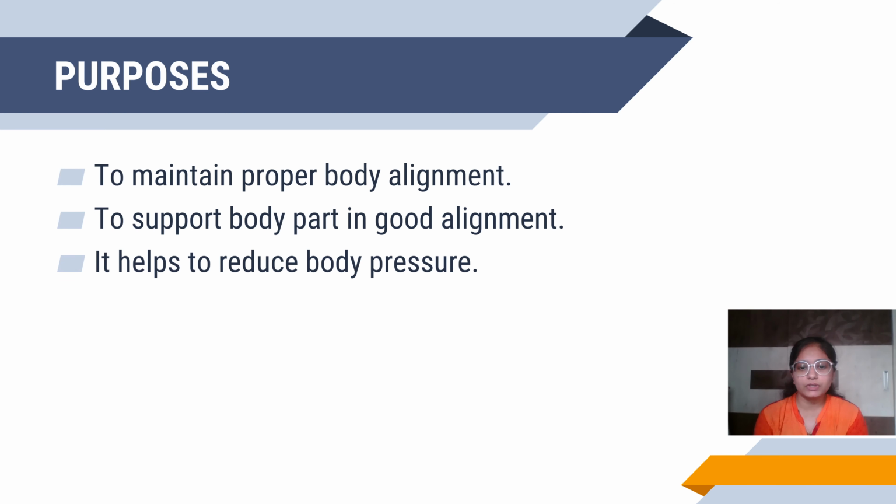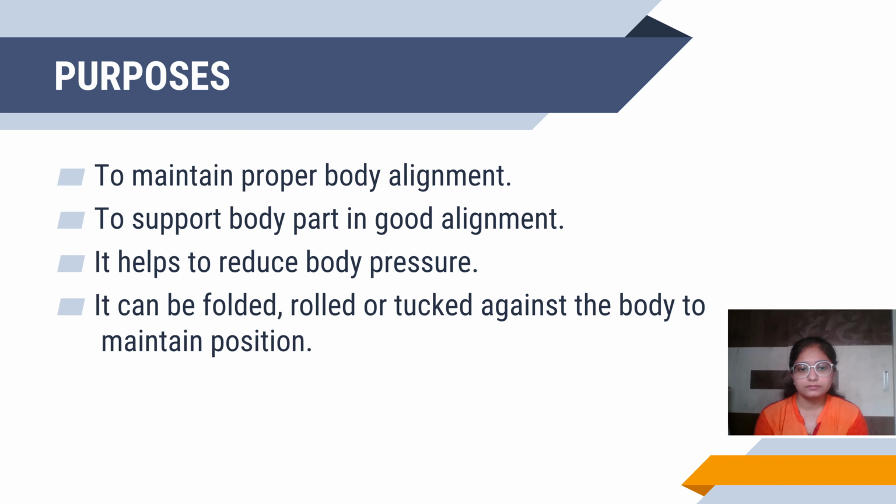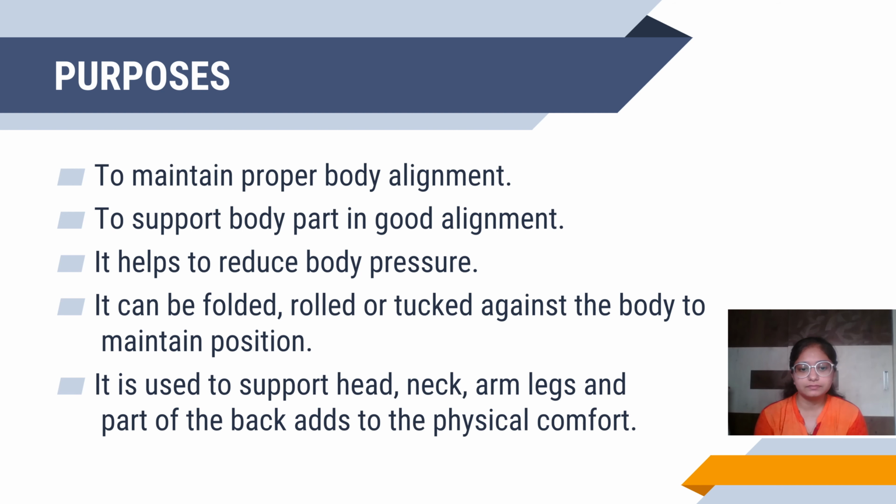Pillows help to reduce body pressure. Pillows can be used by folding, rolling and tucking against the body for maintenance of position. They are also used for supporting the head, neck, arms, legs and part of the back, which adds to physical comfort.